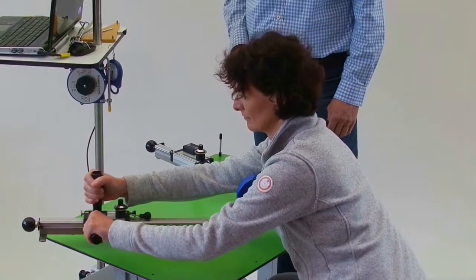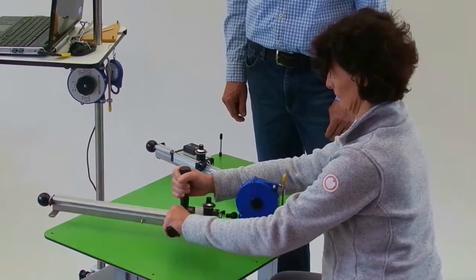Now the balancer supports the patient during the straightening of his upper body.